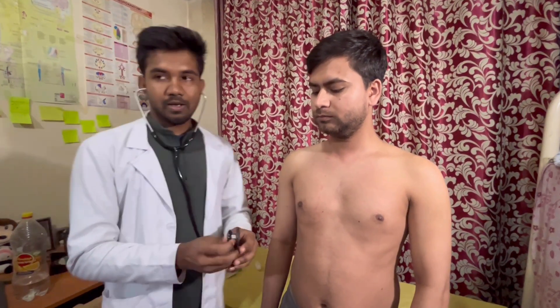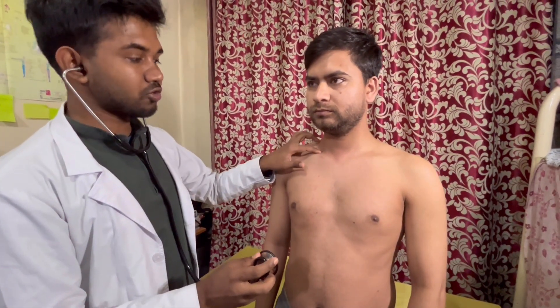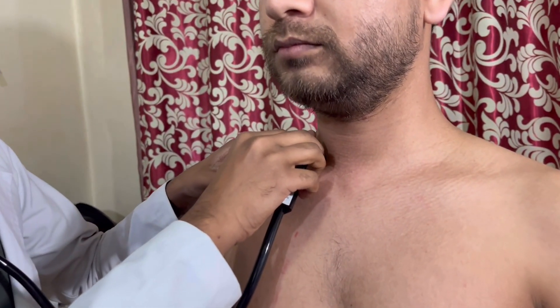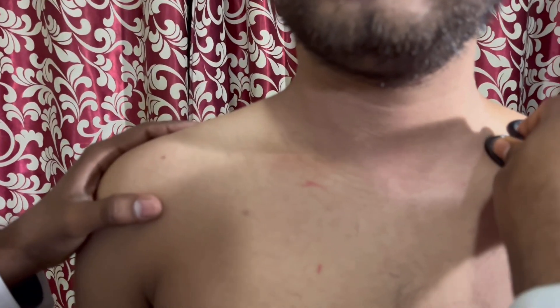Clean the stethoscope with a cotton swab. For auscultation of the lung, we start from the supraclavicular fossa on the right side, then the supraclavicular fossa on the left side.